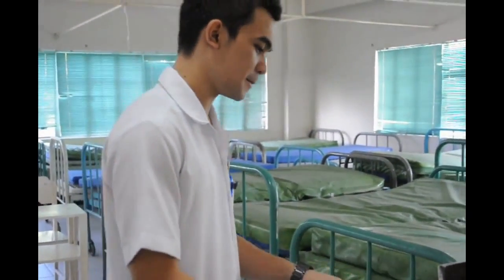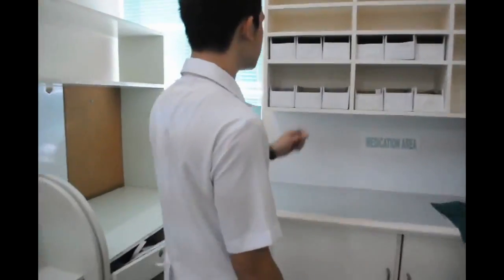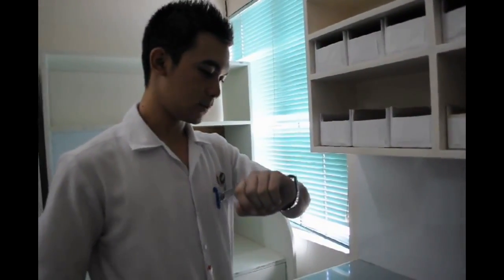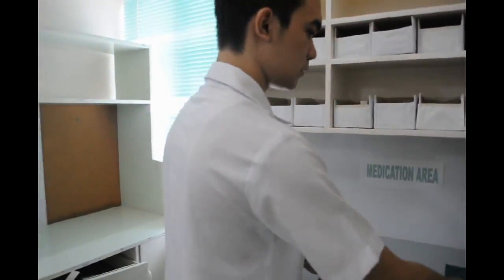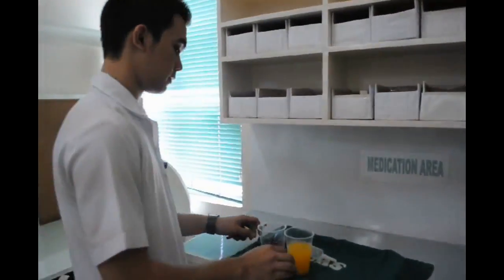Here's the medication ticket. NGT feeding at 3 o'clock. Oh, it's almost 3. I need to prepare now. The water, the blenderized feeding. Okay, and of course, the medication kit.